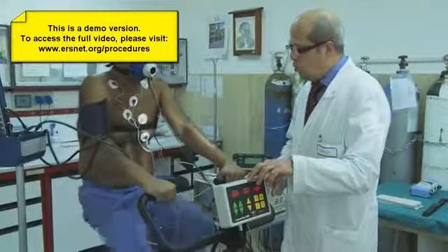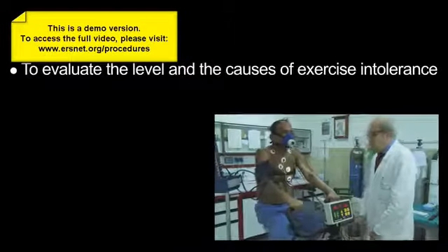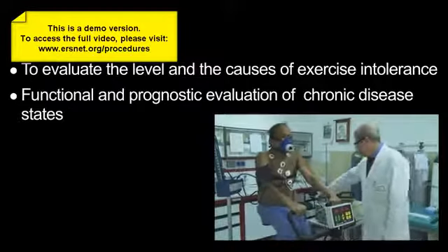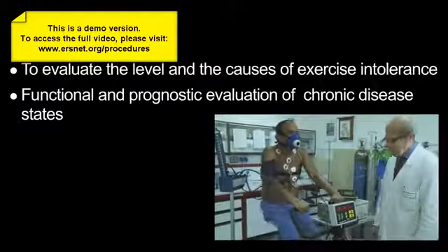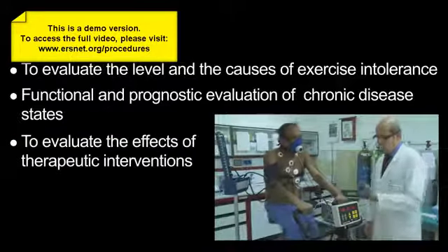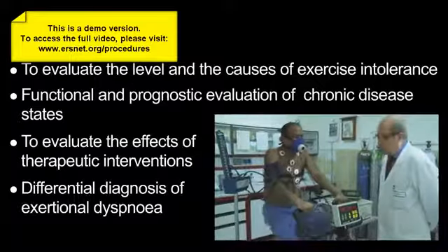The main purposes of clinical exercise testing are: to evaluate the level and the causes of exercise intolerance; functional and prognostic evaluation of chronic disease states such as COPD, interstitial lung diseases, pulmonary vascular disorders, and chronic heart failure; to evaluate the effects of therapeutic interventions such as pulmonary rehabilitation; and differential diagnosis of exertional dyspnea.